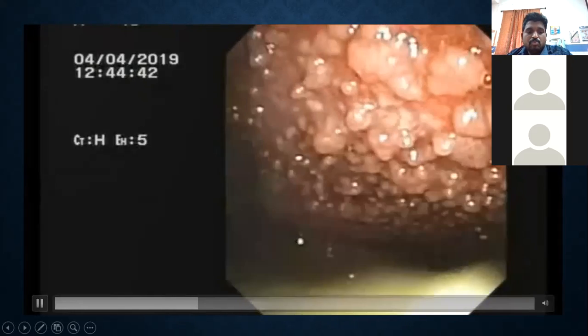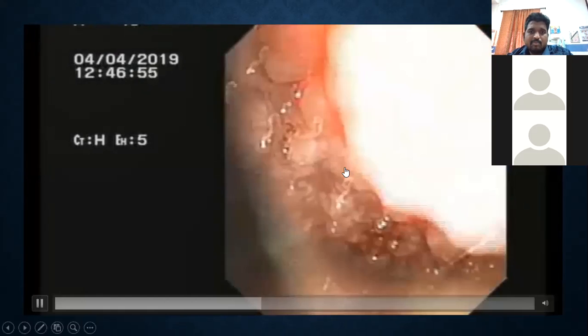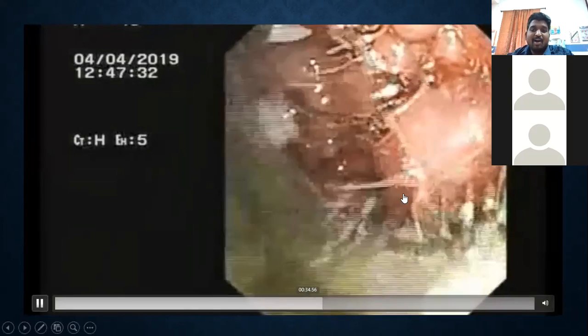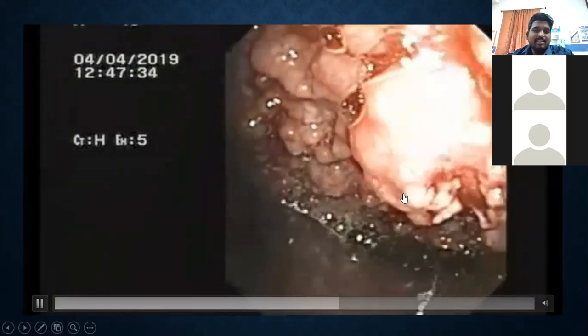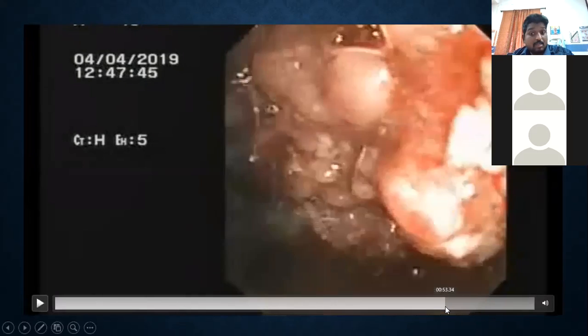When you give a thoracoscopy report, always give a very clear description of the macroscopic findings, so that it gives a good impression and a good clue to the pathologist about what they are dealing with. In this case, we thought it was a malignancy, but finally it was CBNAAT positive and it was tubercular pleurisy. So it looks very similar.